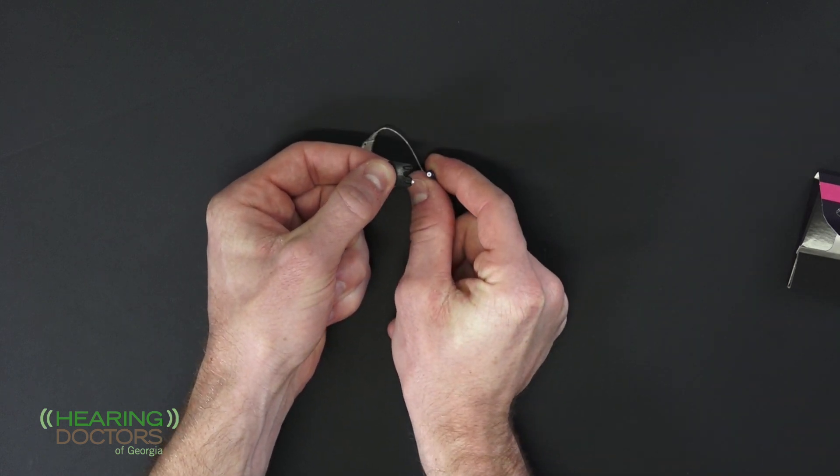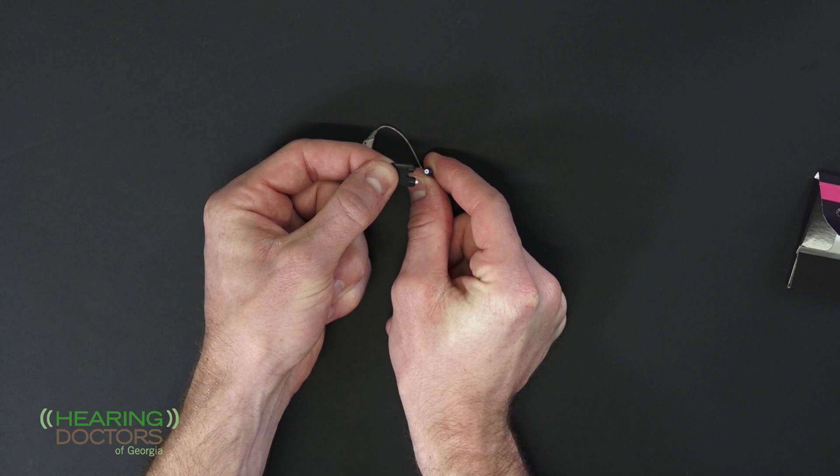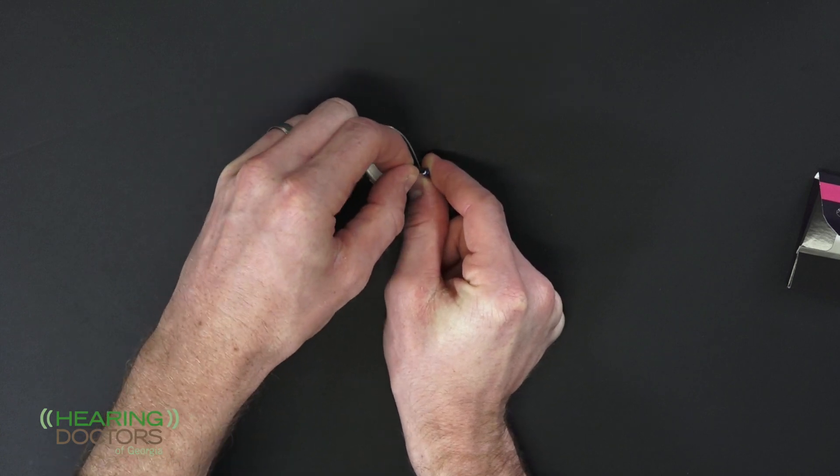You hold the receiver, press the end with nothing on it into the old filter until you feel it click.